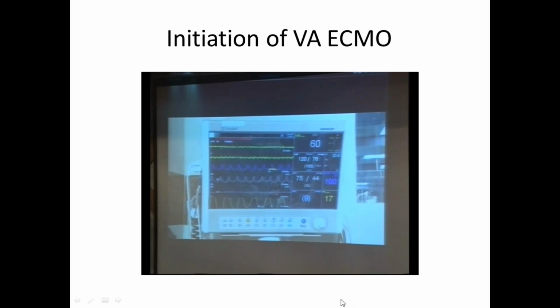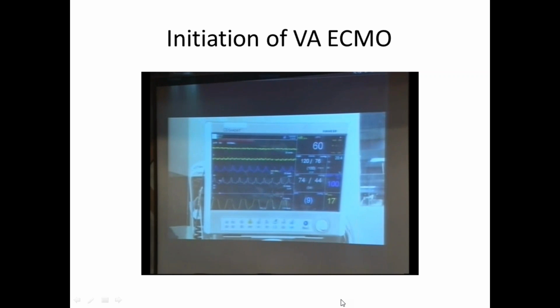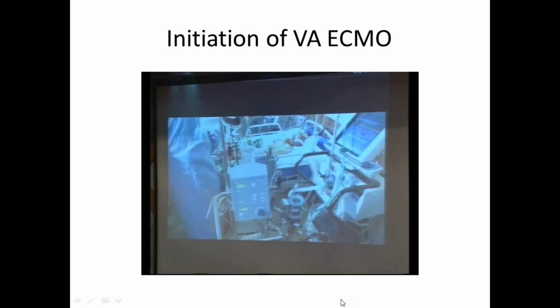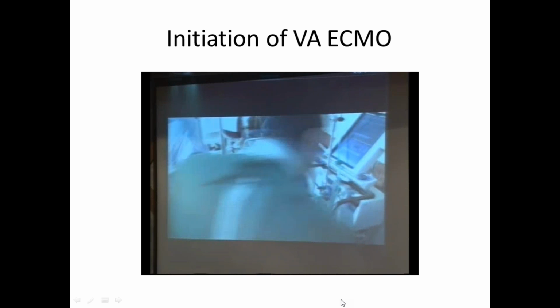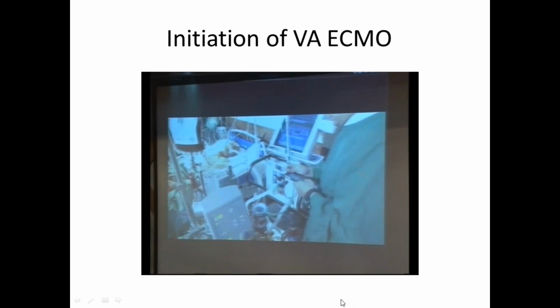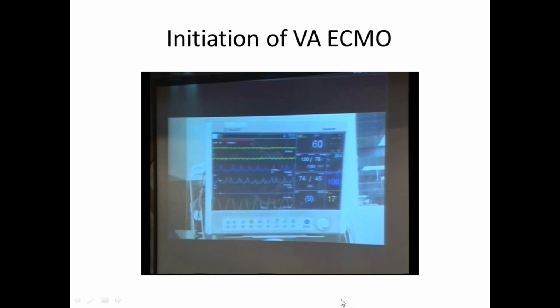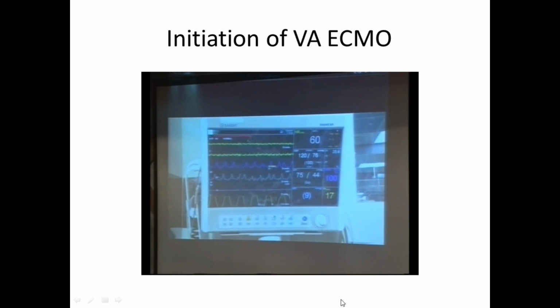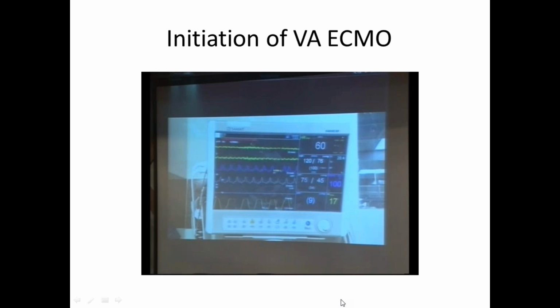Gradually the pressures will improve, and depending on that, we keep on giving them more flow. We'll increase the flow till the time we get adequate pressures. Pressure is 75/45. Saturation has come to 100%.